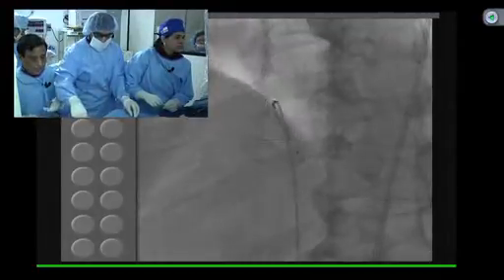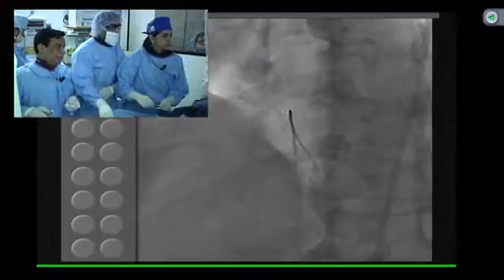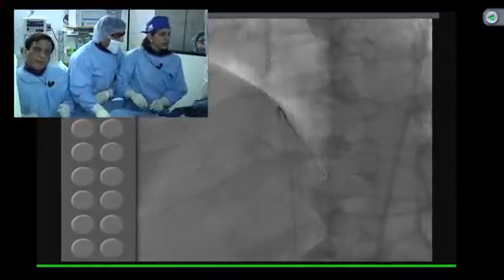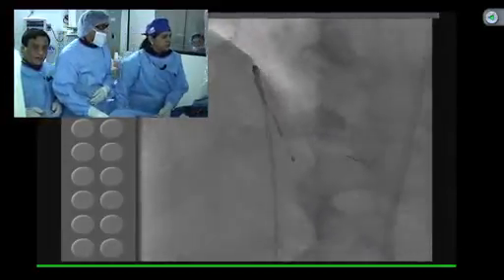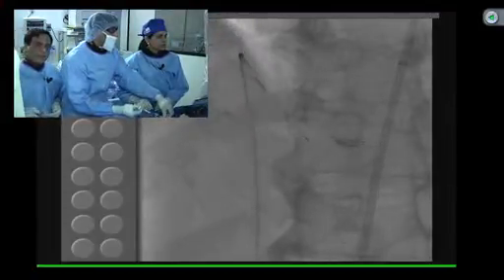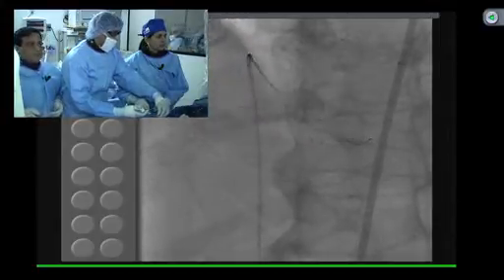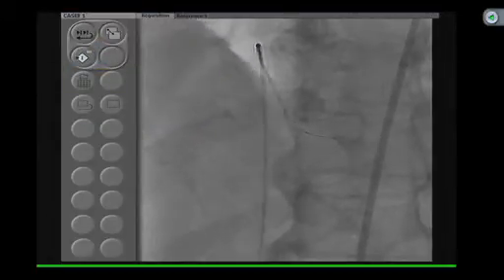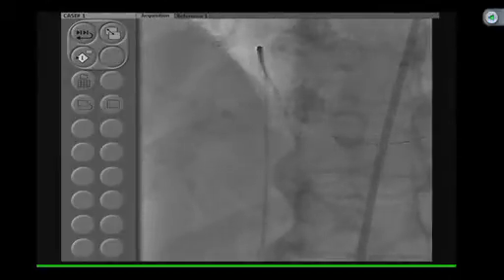And clearly both the everolimus as well as the paclitaxel-coated stent have been approved for in-stent restenosis of the bare metal stent now. But you would not use the rotablator in those cases? Yeah, rotablation, based on the ARTIST trial, although our data did show initially a little better results in the rotastent, but overall the reason to use rotational atherectomy would be if you see a visually unexpanded stent or there are multiple branches. Those are the cases we'll use rotational atherectomy. Otherwise, rotablation just for routine ISR has gone out of favor, and we also don't use it in our practice at this time.